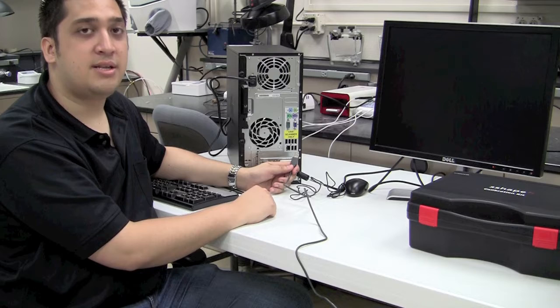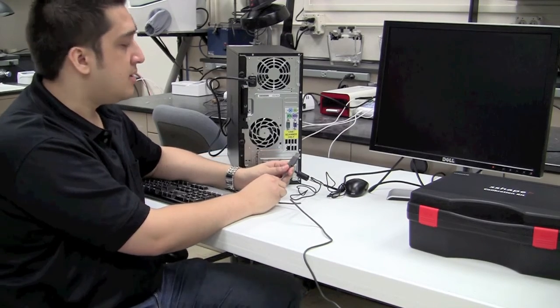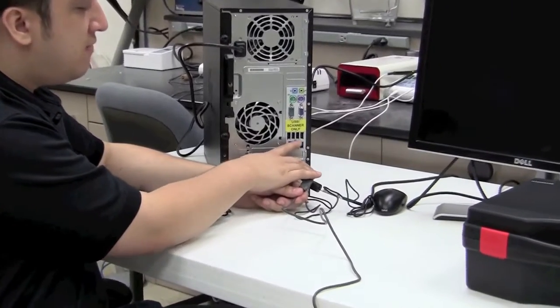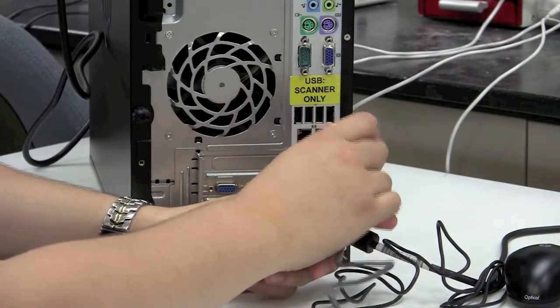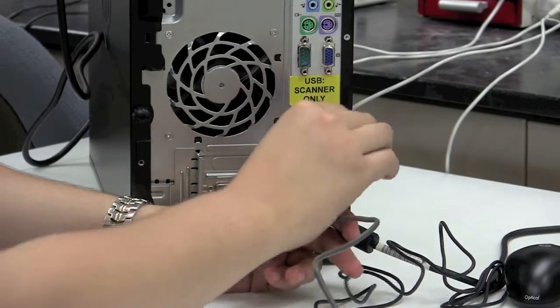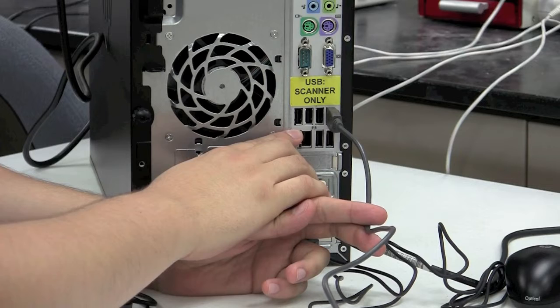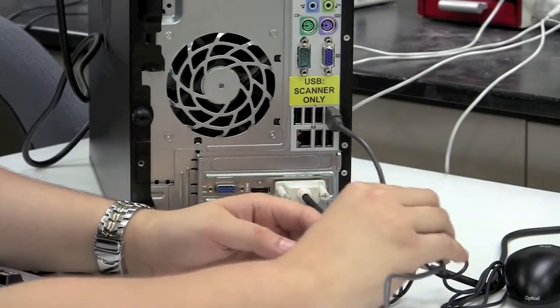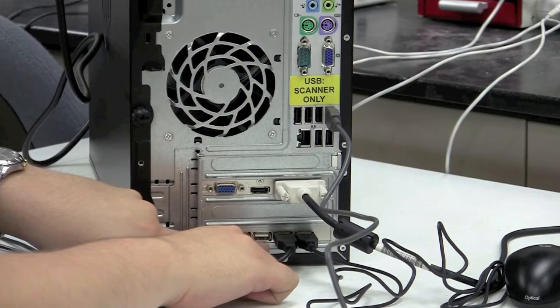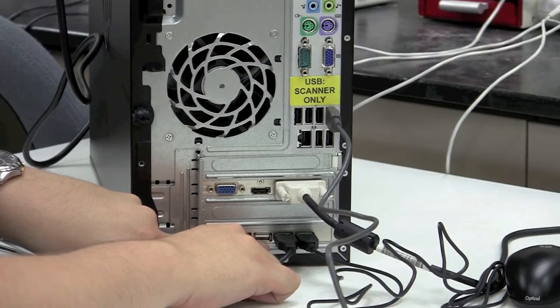Now that the USB cable is plugged into the back of the scanner, take the other end and plug it into the back of the computer into one of the open USB ports. On this computer tower, there are quite a few ports to choose from, and there's a sticker stating to use those USB ports only for the scanner. All of those USB ports share the same bus in terms of traffic, so do not plug another peripheral device, wireless adapter, or printer into them, as it could interfere with scanner data. Your additional ports on the back of the PC tower are down below where you plugged in the mouse and keyboard, with two additional ports there — one of which will be used for the 3Shape license dongle.